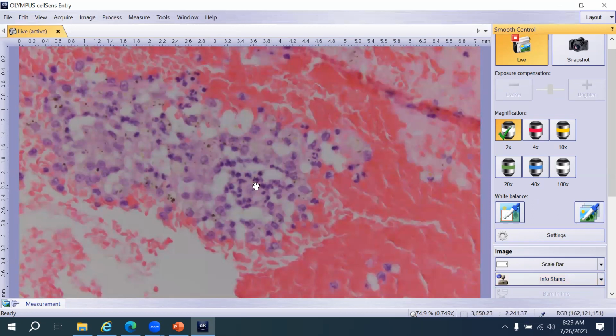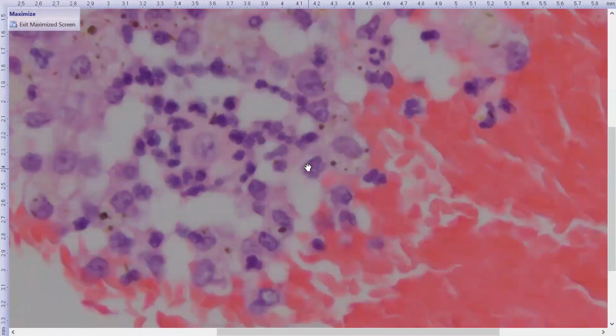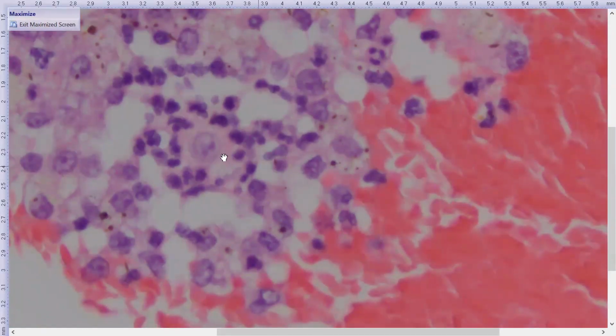Interesting. So here it is though. Full screen. Oh, right. I should go full screen. Maximize the screen. Technology, am I right? All right. Can you focus a little better? Let's scroll on the mouse. Oh, a little pixelated, but yeah. I think it's relatively better.